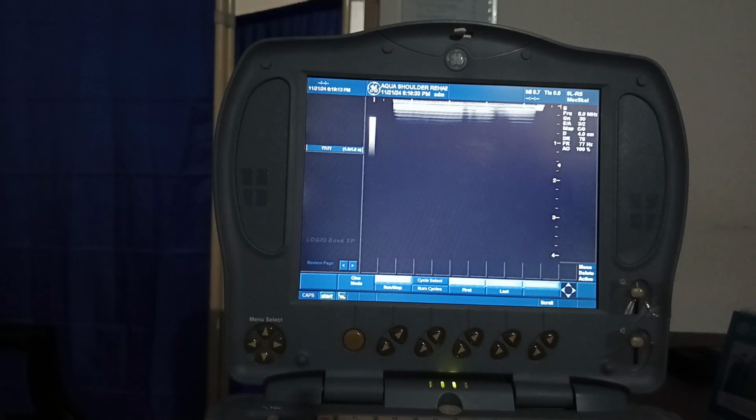Bismillahirrahmanirrahim. In this video, we are going to talk about tissue differentiation or identification using musculoskeletal ultrasound. So, first of all, we are going to see how the muscle is going to appear on musculoskeletal ultrasound.